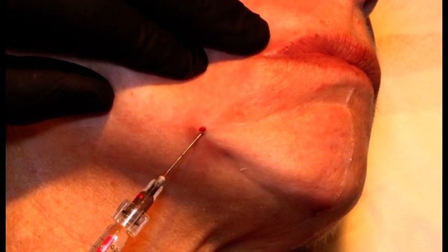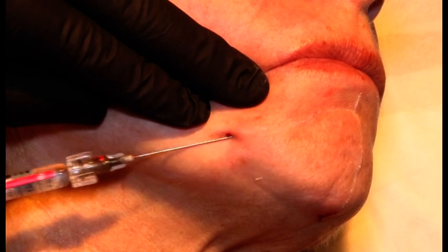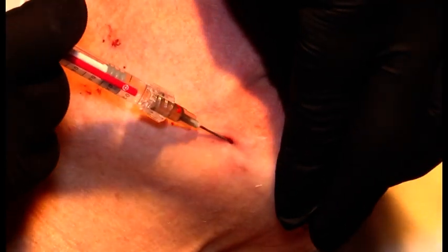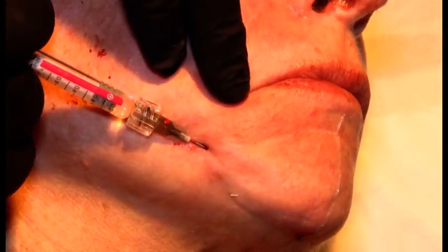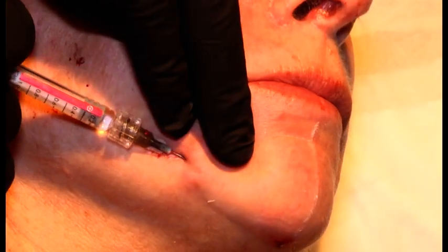And I inject a retrograde linear thread. And also, of course, I can work on the contour. You can also do this with Radiesse, obviously. But with Belotero Intense, it also works very, very nicely. Subcutaneous.